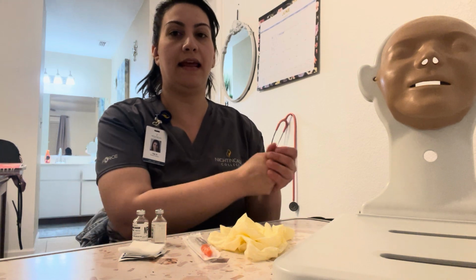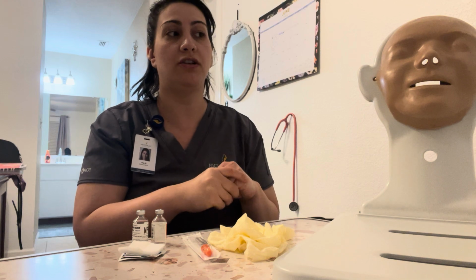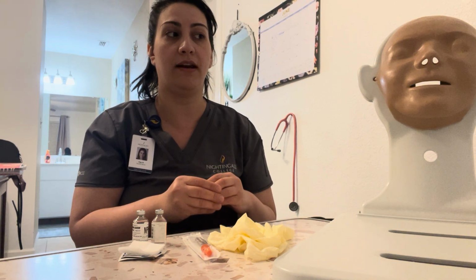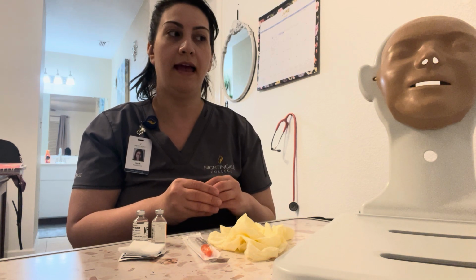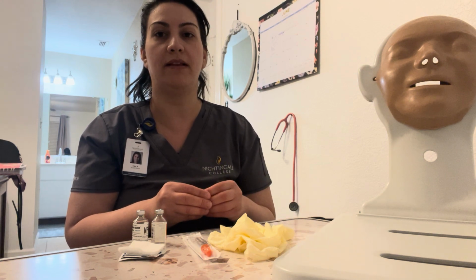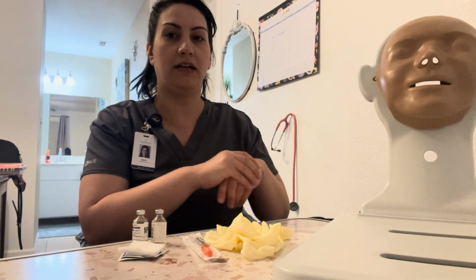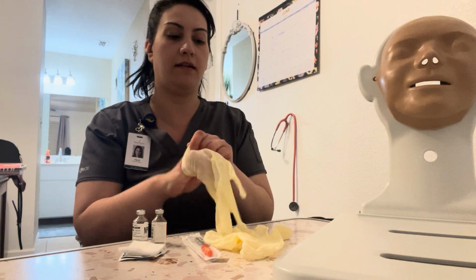I'm going to go ahead and hand hygiene here, and I will also want to let my patient know upon the injection you might feel a little bit of stinging and burning. That is normal, unfortunately. And I will go ahead and grab her glucose levels, and I will determine when the next meal is. Hand hygiene here, and I will put my gloves on, and we're going to get started.